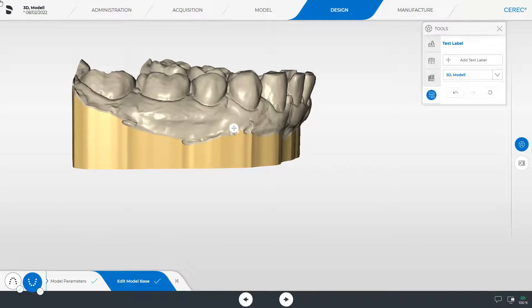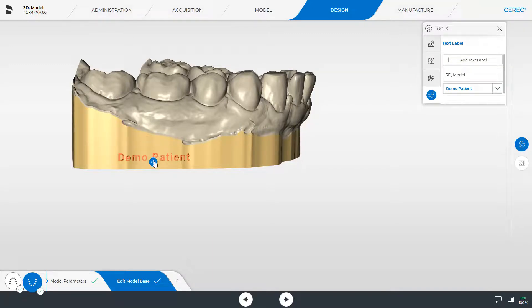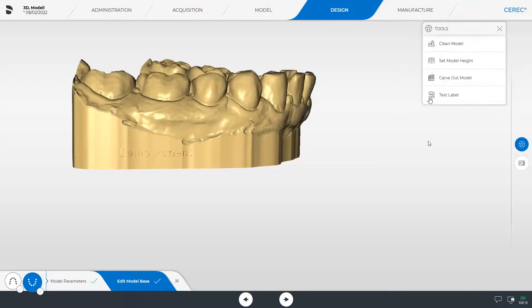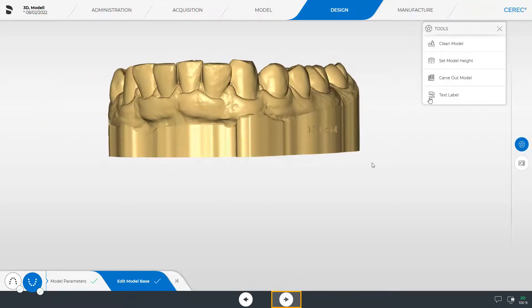Alternatively, a customized text can be created. We again click add text label, enter some text, and move it with the small icon to the desired location on the model base. We disable the tool again and switch to the manufacture phase.